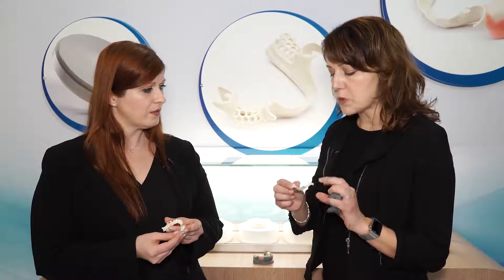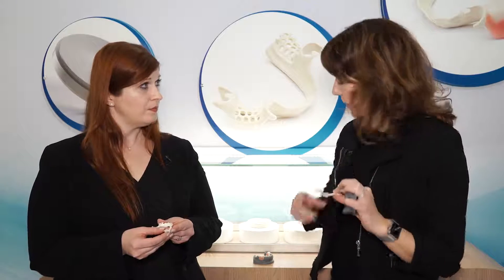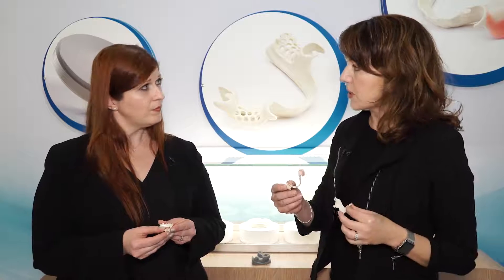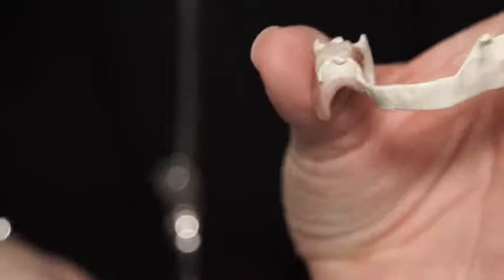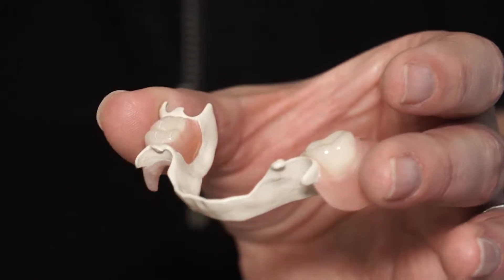It looks very smooth. Can you tell me about the polishability of it? It polishes up very nicely. When it goes to try-in, it comes straight out of the disc, and then when they put the acrylic on it, they'll just polish it up while they're polishing the acrylic, and it can get a mirror-like finish. It's very nice and smooth, it feels good in the mouth, and it feels good against the tongue as well. That sounds like it would also repel bacteria pretty nicely. We believe it can — we have a nice biofilm study going, comparing it to materials currently used today, and in the coming months we'll be communicating that to the market.